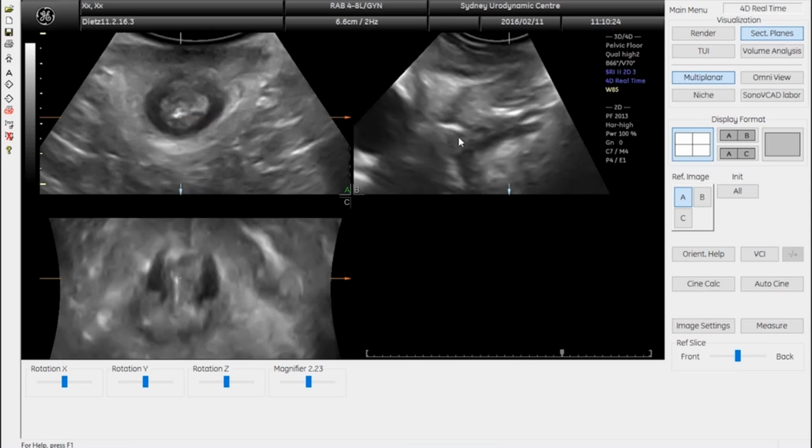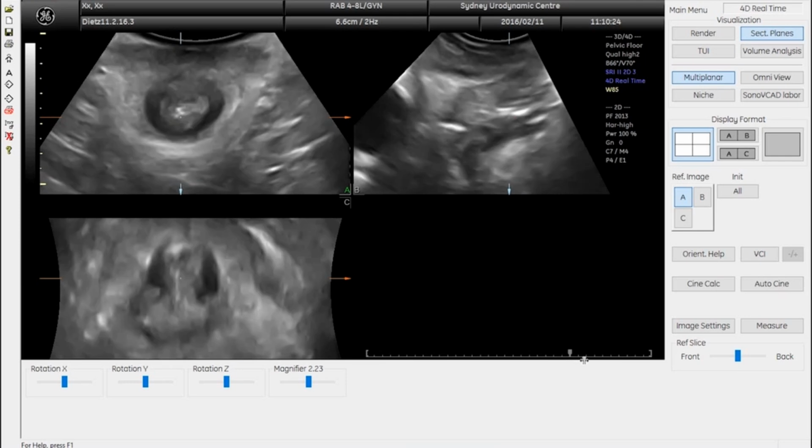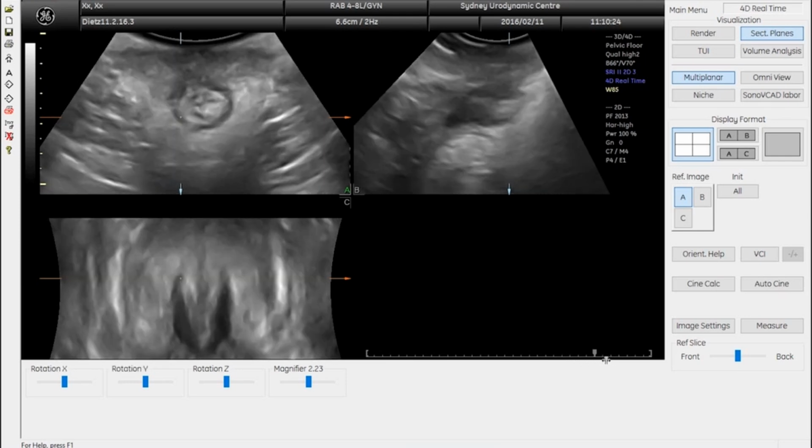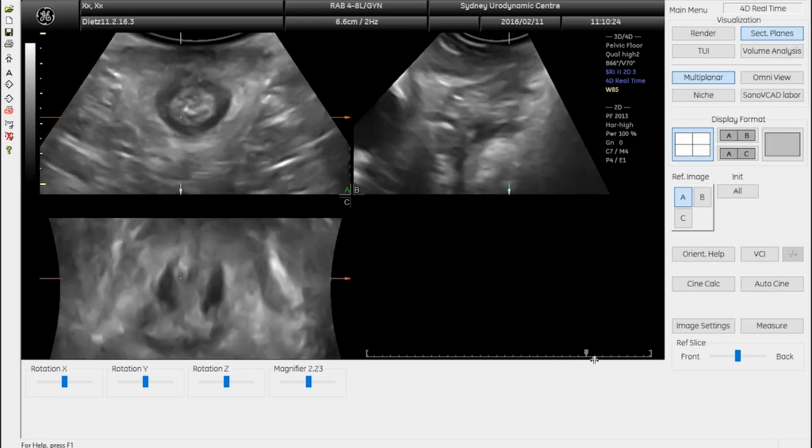That is the rectal ampulla here, the internal sphincter here and barely visible here, and the external sphincter somewhere here, the anus further out. This here is an axial plane which we haven't really used yet. We start by letting the patient do a pelvic floor contraction to see whether that improves imaging at all, and I think this particular frame is probably the best.